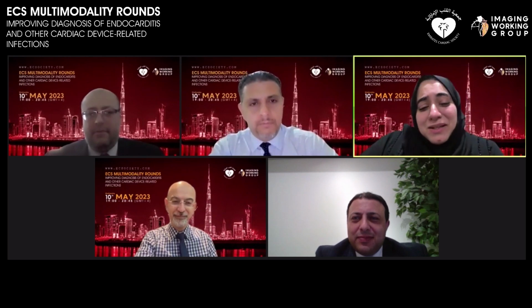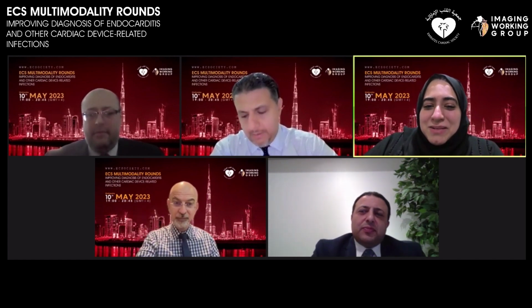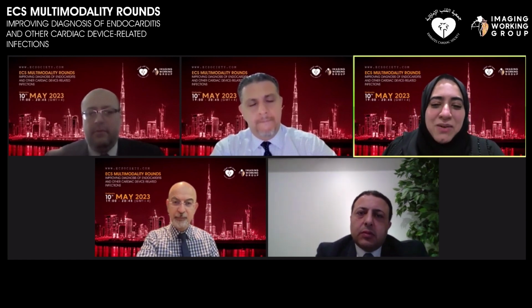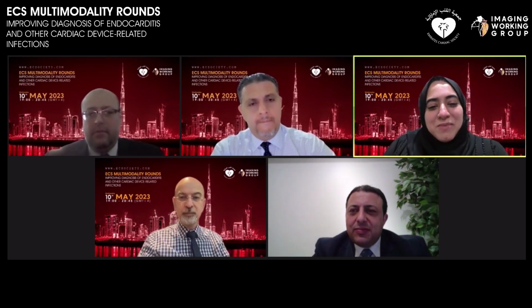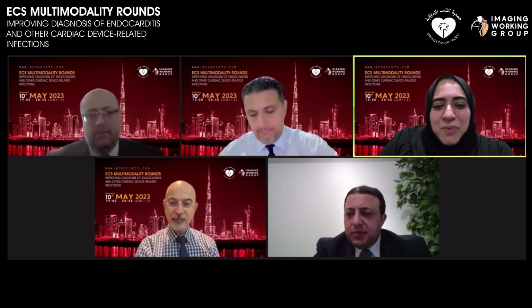I actually have a question. I think it can go for both speakers, and also for you, Faras, you can give an input on that. It usually makes sense when the patient presents like a book, right? Fever, bacteremia, and these things. But sometimes we get on screening echo something that looks like vegetation, and then you're trying to establish if this is infective endocarditis or not. And then it becomes complicated, especially with what you said, Dr. Muad, that the PET will not tell you whether this is vegetation or not, especially in a native valve. So what's your approach in something like this?